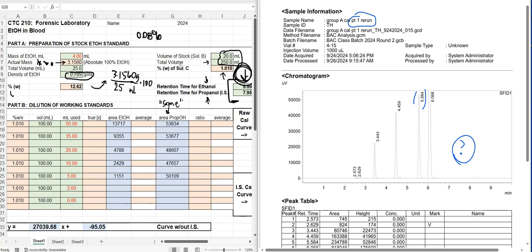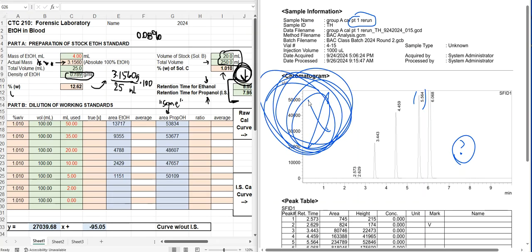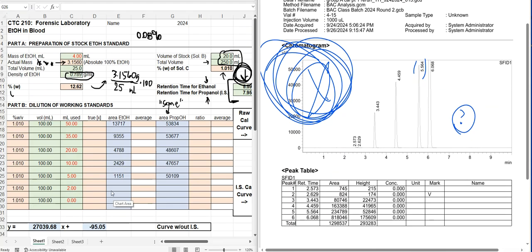So, guess what? Whammy, whammy, whammy. They just didn't do very good sample prep here, and I get to call them out on it. Well, okay, we could include the ethanol peak. So I'm going to go to the spreadsheet right beside where it says 2 milliliters. I'm going to key into that box the area for ethanol at 5.56. So 2, 3, 4, 7, 8, 9, and then I hit enter. That's what that number says. 2, 3, 4, 7, 8, 9. And there's no internal standard peak at all. So over here to the side, I'm going to put 0.